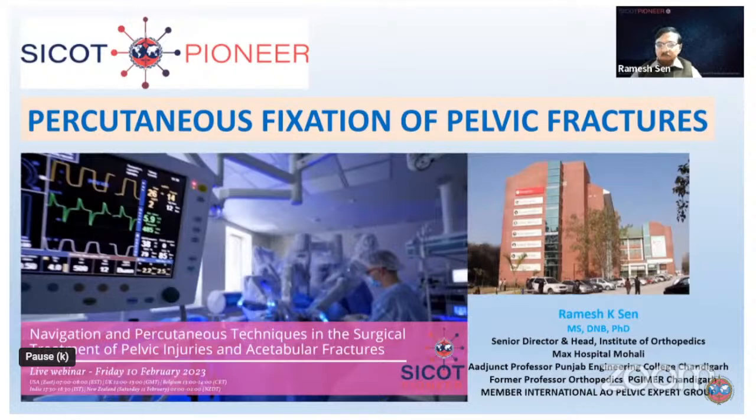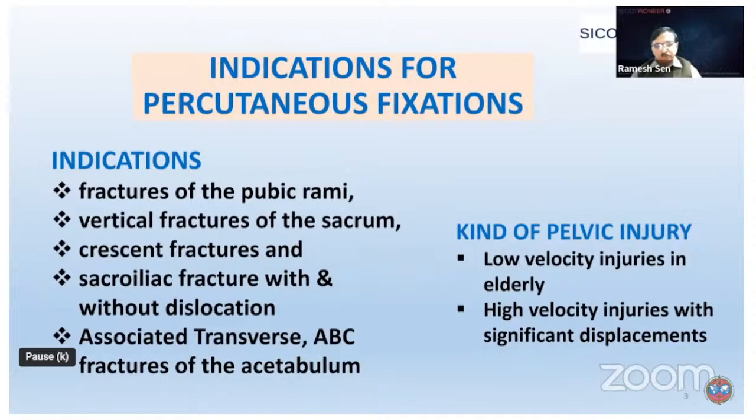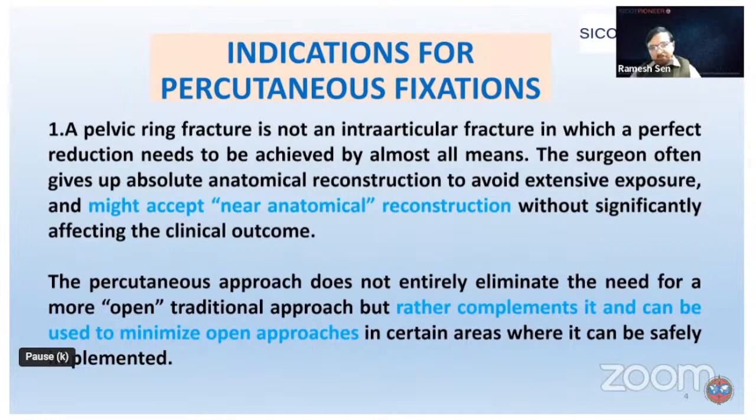As has been talked about, we are likely to be dealing with fractures around the pelvis, anteriorly, sidewise, and posteriorly, depending on the fracture morphology. But we must perceive the fact that if the fracture is displaced, it requires reduction also. So how a reduction can be obtained and how subsequent stabilization is to be done. In low velocity injuries, most of these cases may not be displaced, but in relatively high velocity injuries, reduction is the main thing.